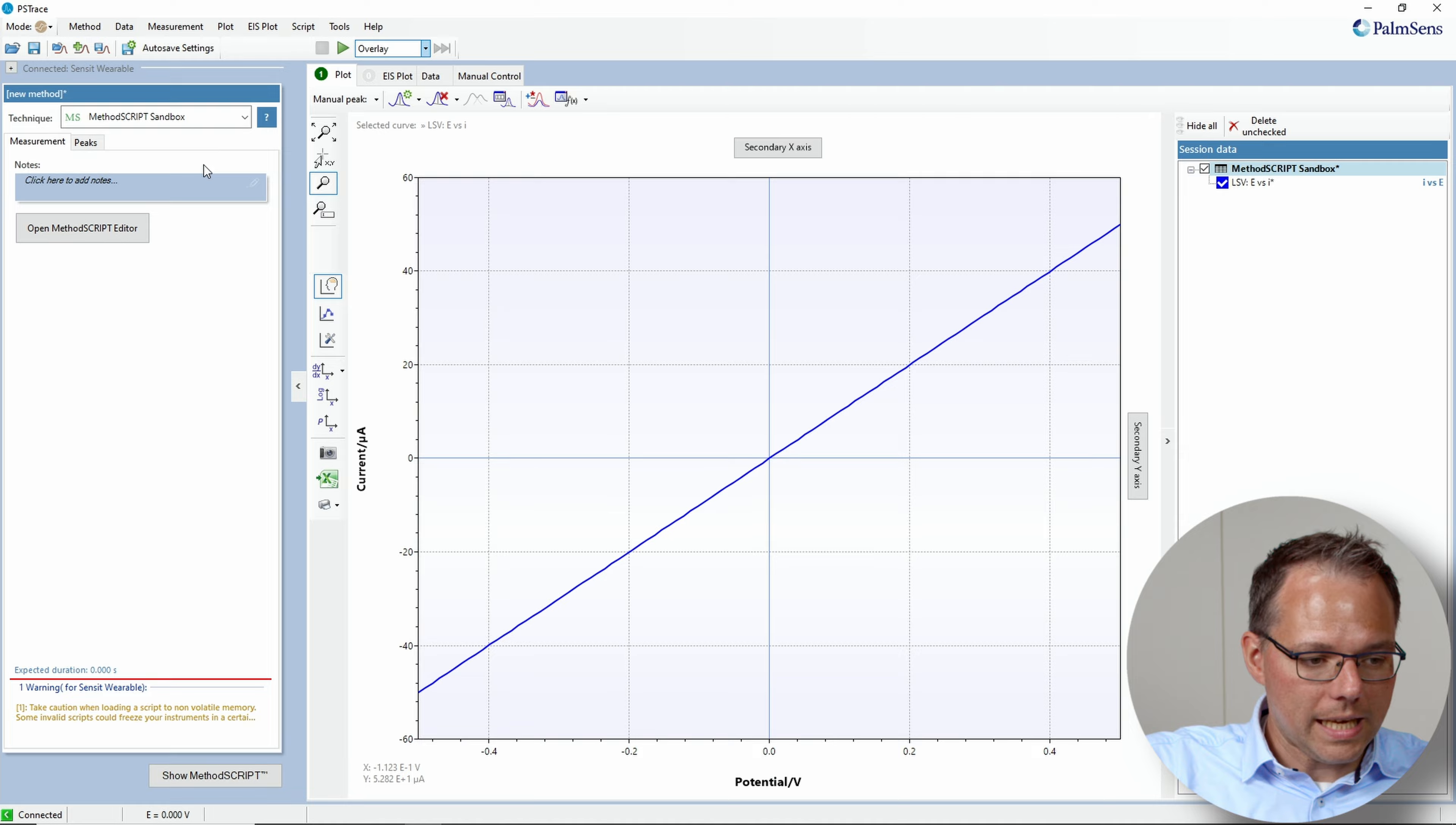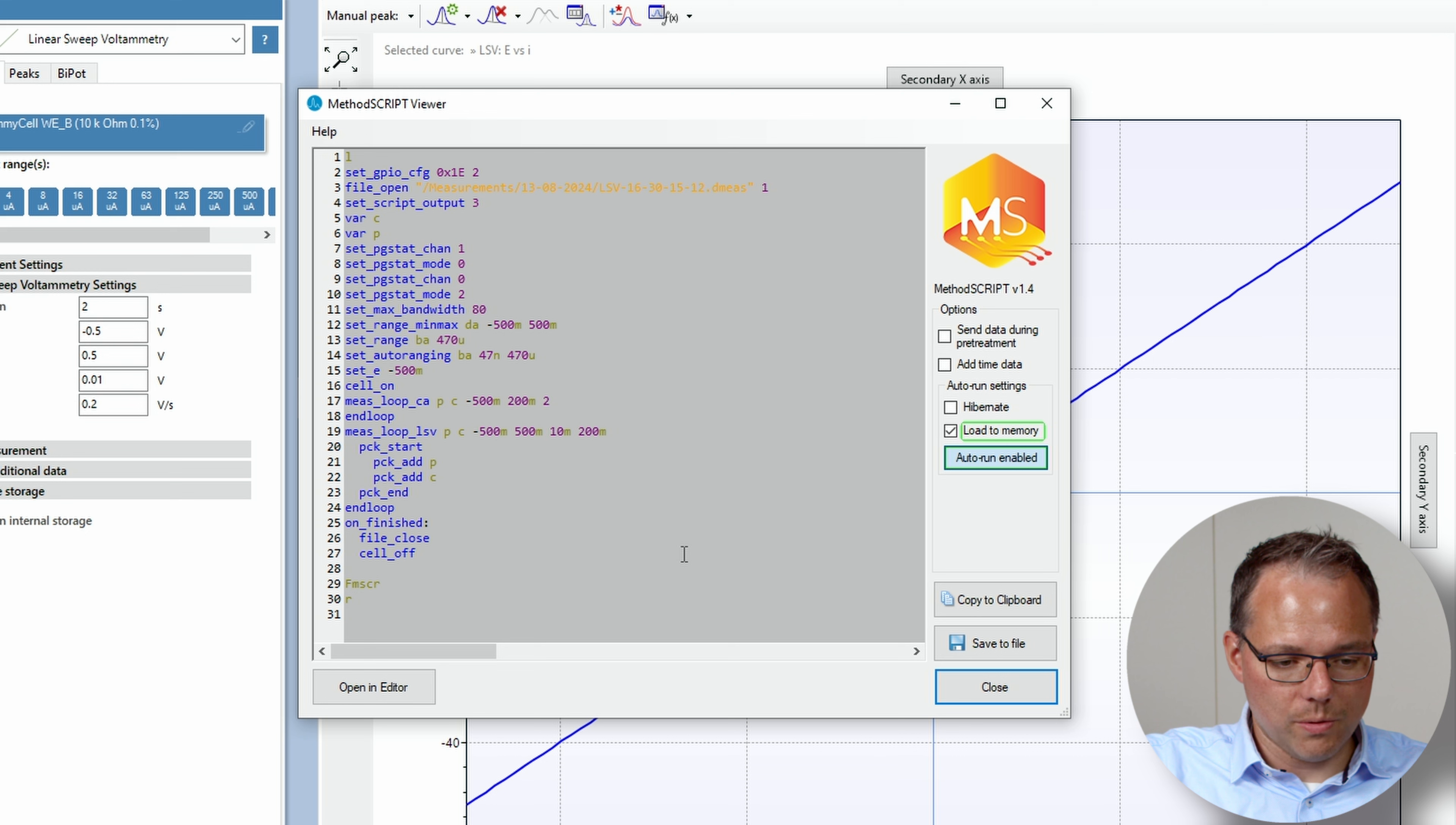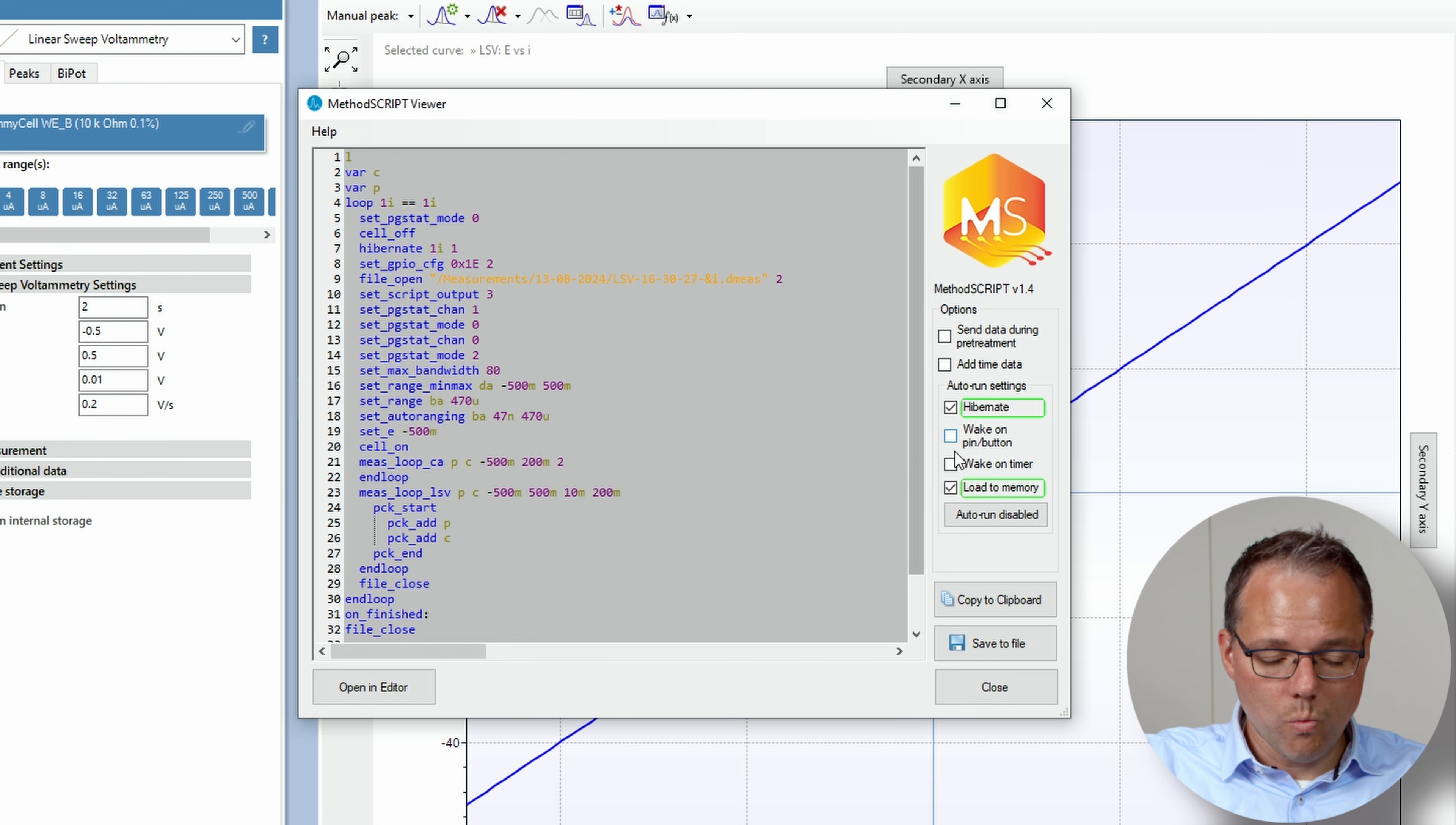So again I go to my linear sweep voltammetry and I open the method script viewer. I don't really need the auto run function I can just switch it off. But what I want now is I want the device to hibernate and only do a measurement when I ask it to do the measurement.